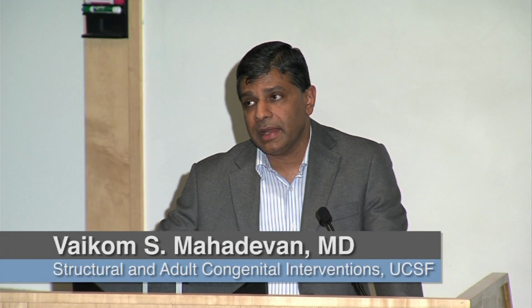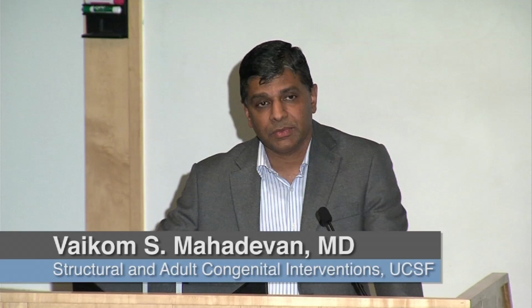There's no question. Well, there are a number of minor complications and major complications. The minor complications, you can cause trauma to the vessels. You go in, you can cause small tears in them. You can perforate vessels. That's quite possible. And the biggest risks with TAVR are probably 2 or 3. One is aortic root rupture, because you've got a very calcified root. You're not like the surgeon who can go and remove some calcium and fix it and put a valve in. He can see it directly.